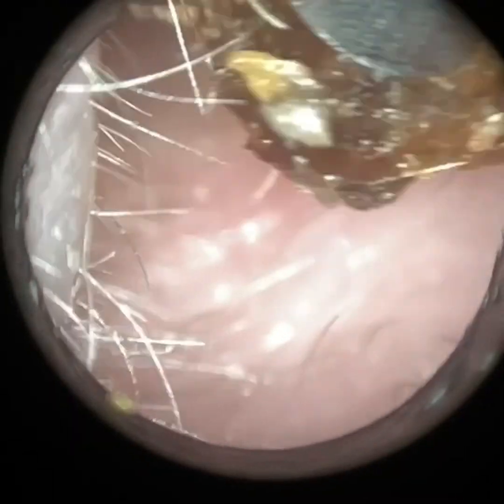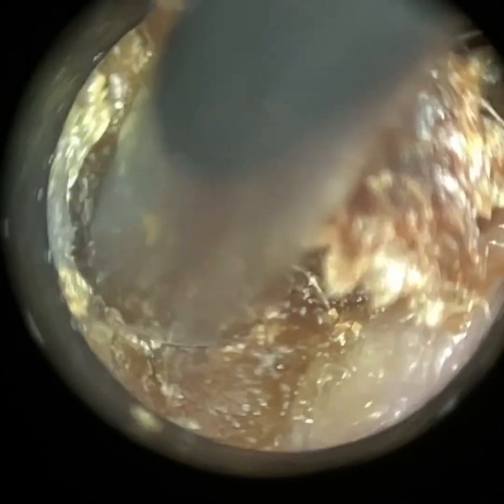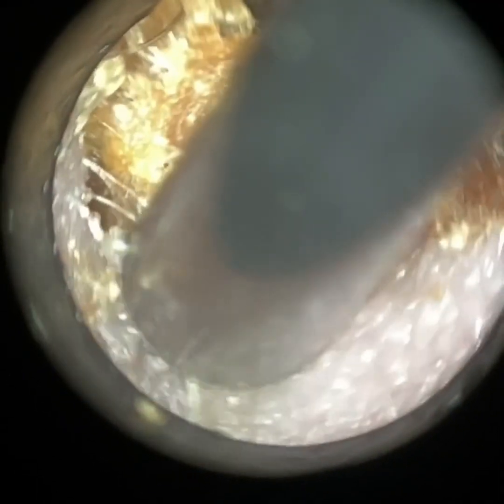There's a lot more dry skin here — you can see those flakes that are really reflective. The flakes of dead skin are reflective because they've got a high keratin content. Keratin is a protein that's also found in our nails and hair. It has several properties: it gives the outer layer of skin some strength and integrity because that's going to be exposed to the external world. It's also highly reflective, which helps to reflect harmful UV sun rays. And it's hydrophobic, so it helps to repel water — we don't want the underlying skin to absorb too much moisture, because then it can cause the skin to macerate, where the skin cells overhydrate with the water, they swell and burst at the membranes, breaking down the outer epidermis layer, which is a protective layer of skin.